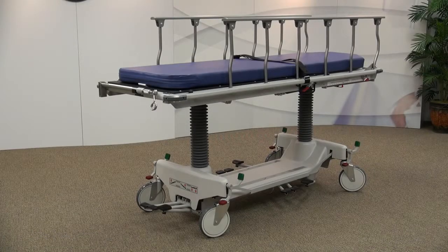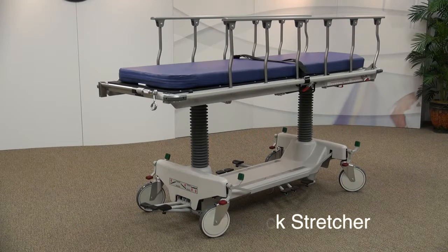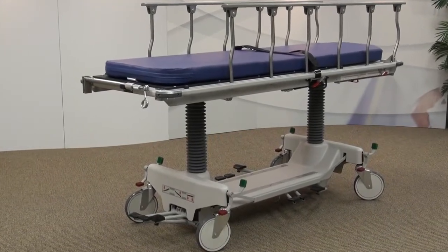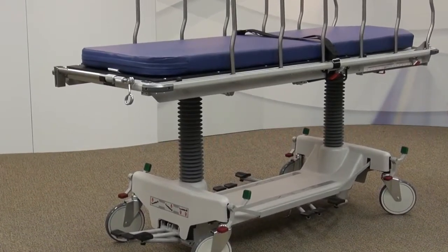Welcome to the Hosted Fluorotrack Stretcher Overview. The Fluorotrack Stretcher is designed to offer the security of a treatment table and the mobility of a stretcher when used with fluoroscopy machines. Let's walk you through the features and benefits of the Fluorotrack Stretcher.